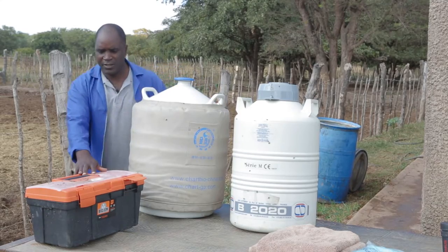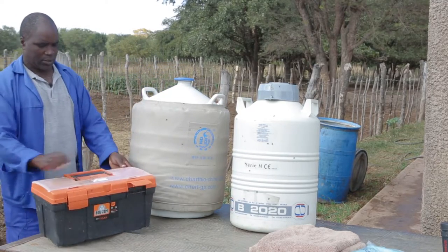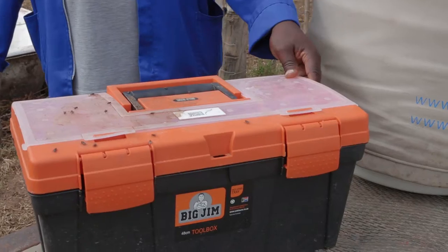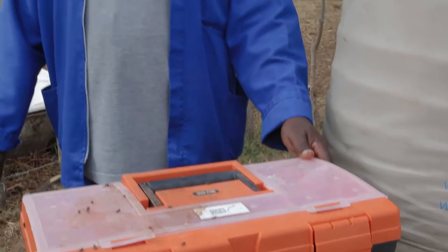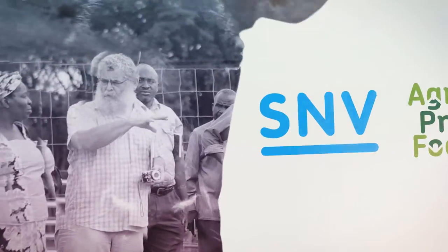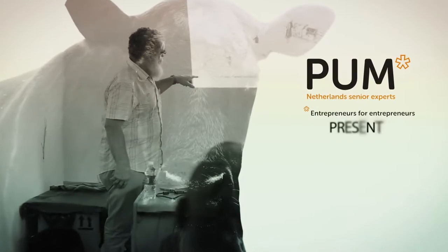And this is an AI toolbox — the toolbox for the AI equipment. We use this to store our AI kit. Thank you.